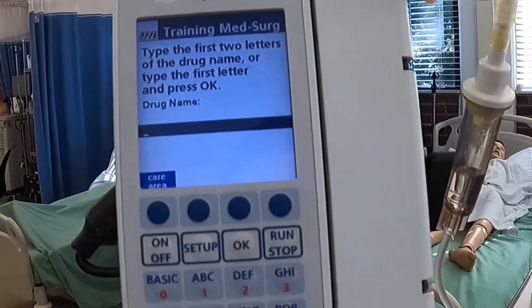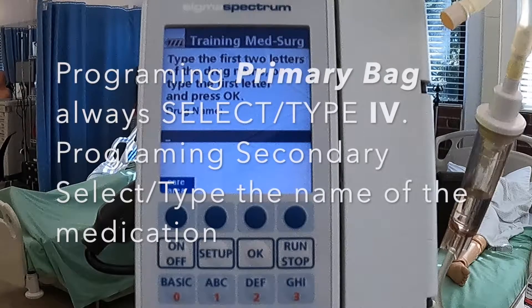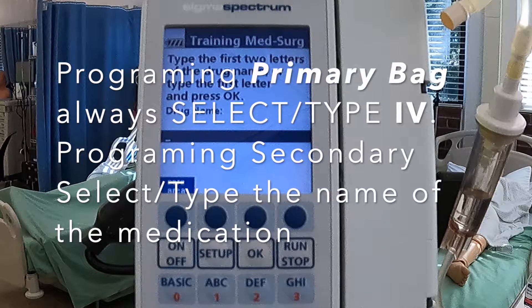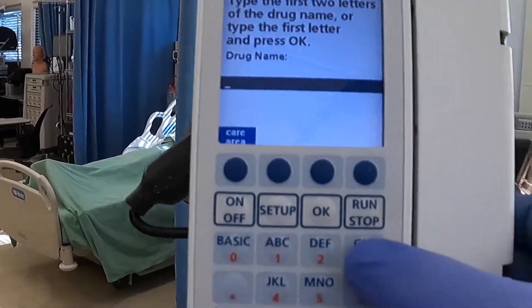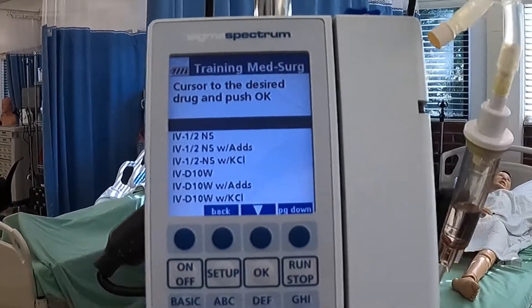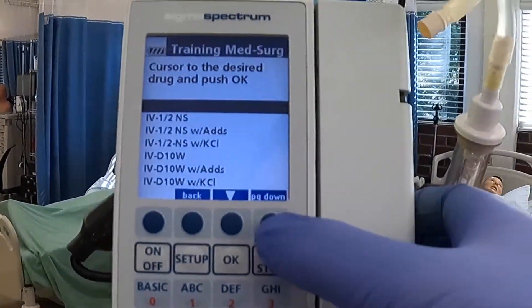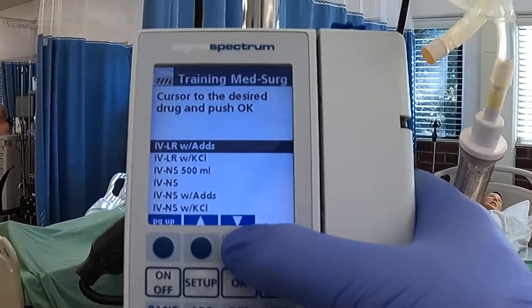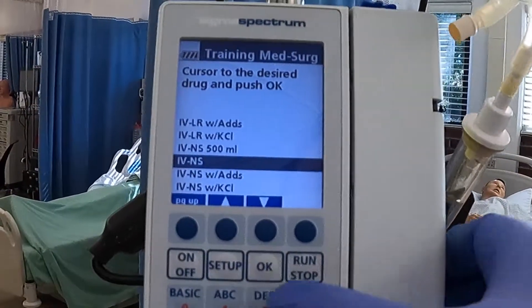It's asking us to type the first two letters of the drug name, or type the first letter and press okay. This is a primary bag, so we have to type IV. Now it comes up with a bunch of different options, so we have to select the correct fluid we're going to hang. We'll hit the page down button, then use the arrow key. I see IV and S, which is going to be IV normal saline, because that is what we hung on Alan Covey. So we'll go ahead and hit okay.